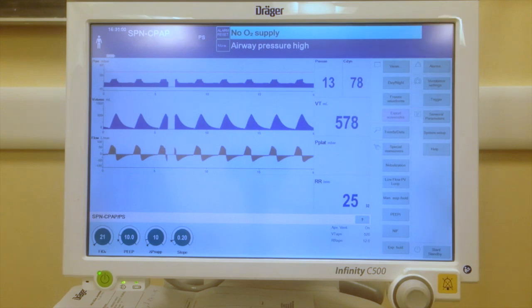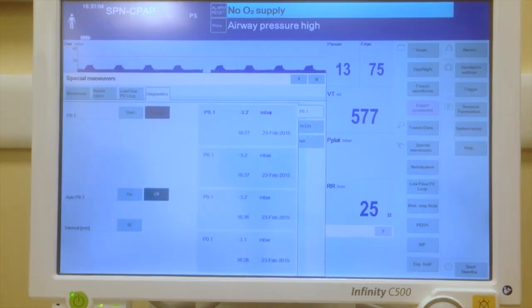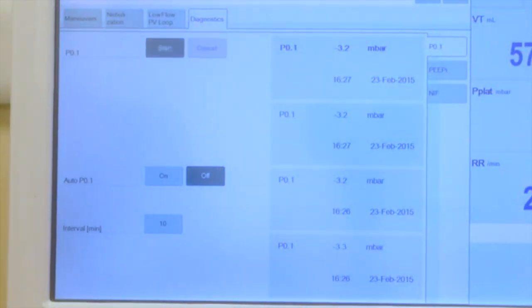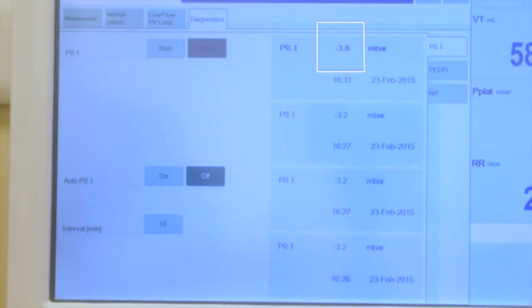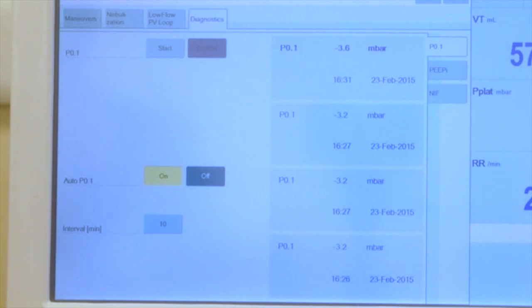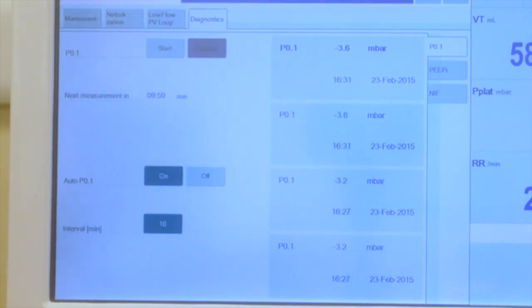This is how we measure P0.1 on a Dräger Infinity V500. We need to go on Special Maneuver and click P0.1, then press Start. P0.1 will be displayed here. We can also tell the ventilator to automatically measure P0.1 at the rate that we decide.